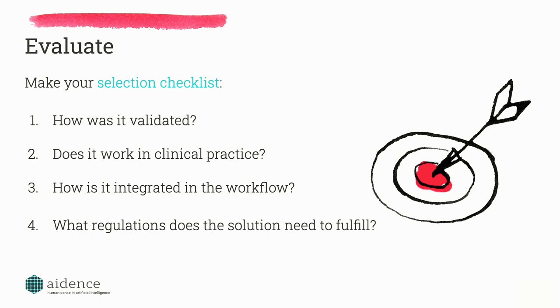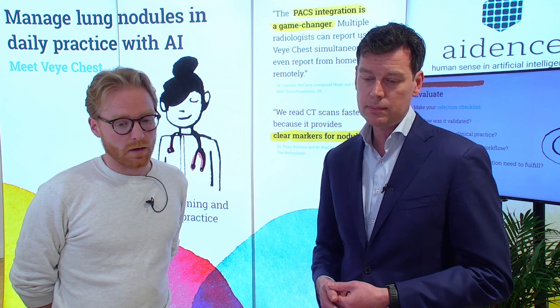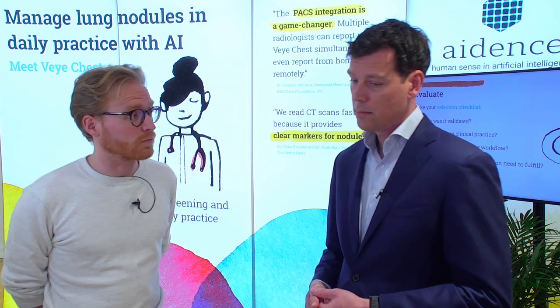Does it fit easily? Is it something that you can add with a relatively low amount of effort, or not? And you get a feel for how complicated it is to get started, because obviously you will want to start with something that's relatively easy to get integrated. Exactly. And then looking at how it's validated, like how have the vendors validated their own solution?